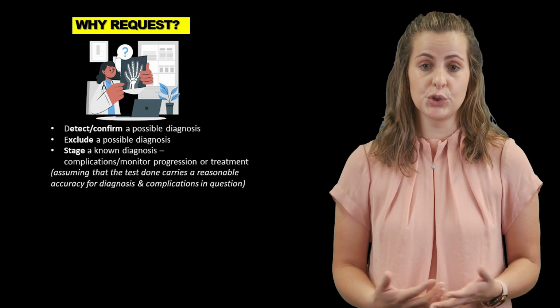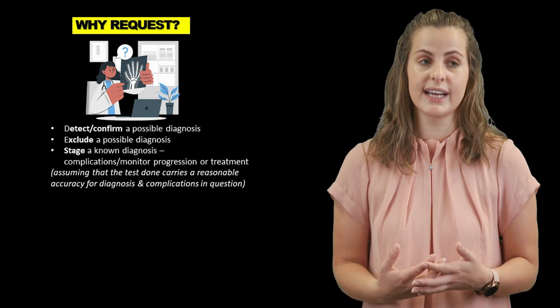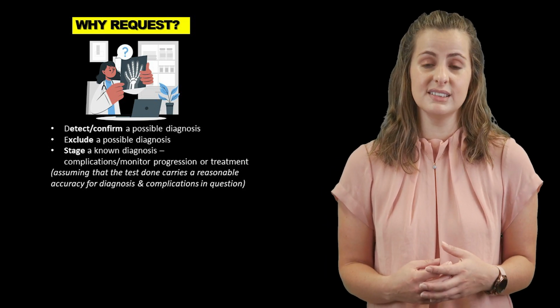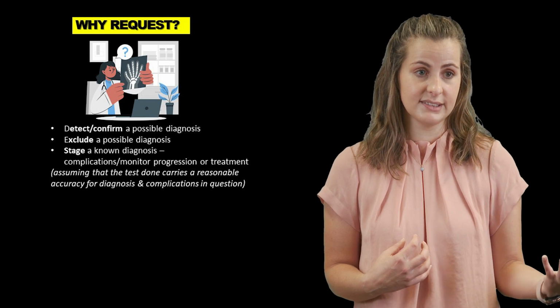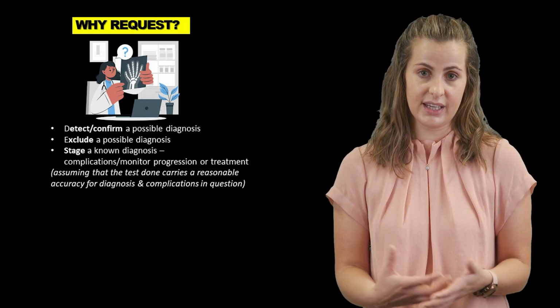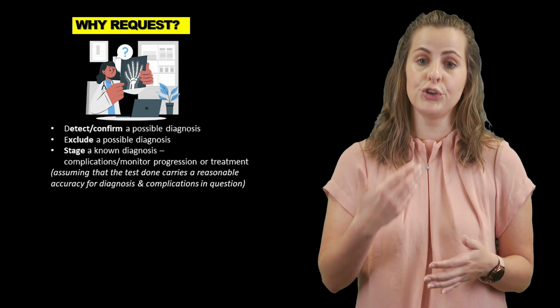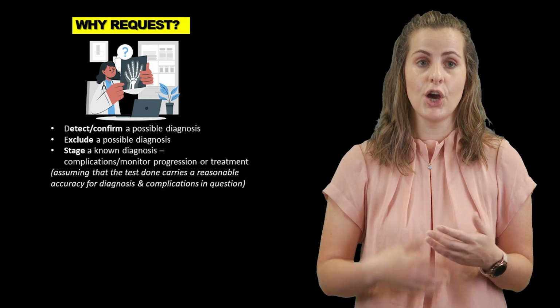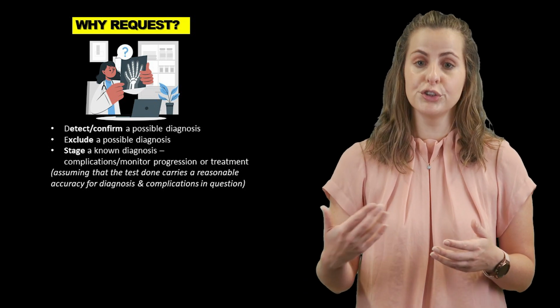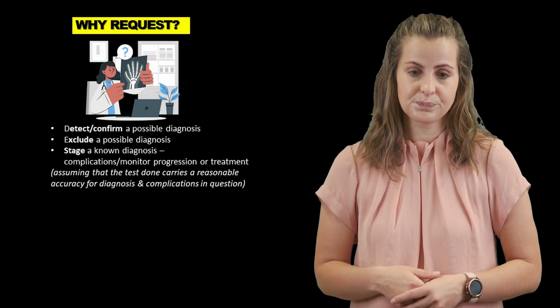In the specific session, we're talking predominantly about plain film radiographs or X-rays, and you will recall that this is a type of radiation-based investigation, meaning that the patient is going to be exposed to radiation. One-off, it's not such a big deal, but obviously the cumulative effects in terms of being constantly exposed to radiation can have some significant consequences.